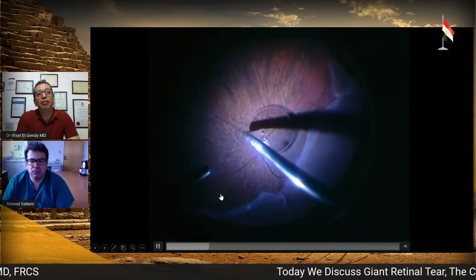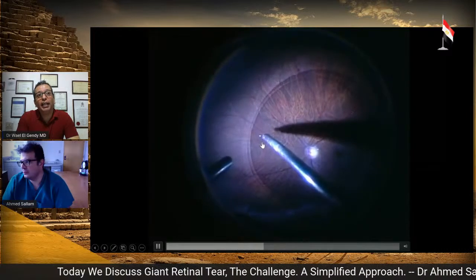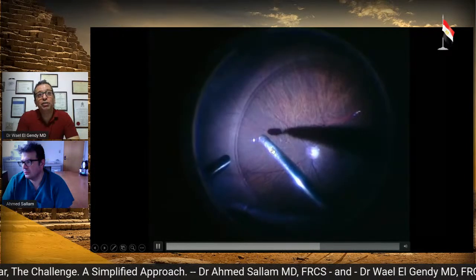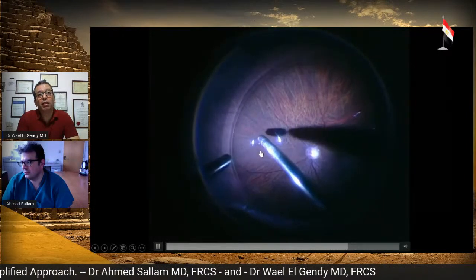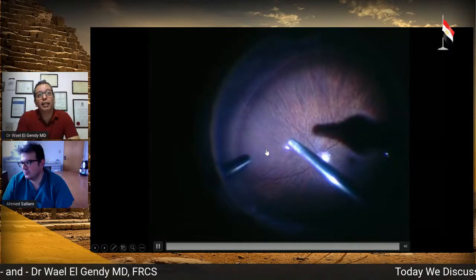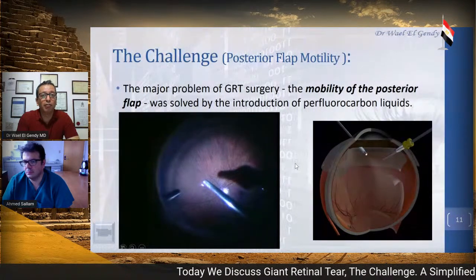Here, injecting the PFO, I can see, we inject it slowly, and you inject it posteriorly, first near the optic disc, and then you start coming up with the bubble, but maintain yourself inside the bubble and slowly inject the PFO. This is what I recommend for doing.